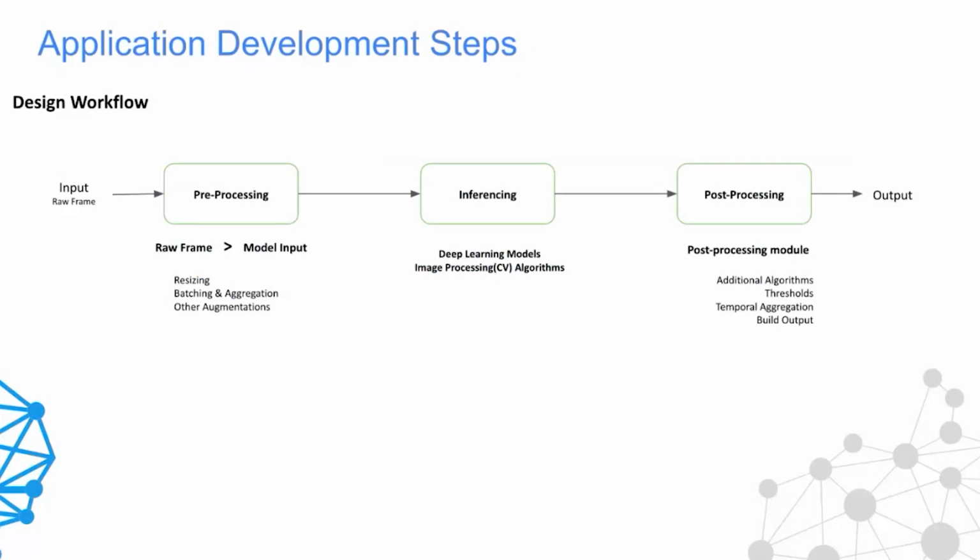So to build the application Cerebro, I have a simpler version of the application I'm going to go through. The first step as part of development of the application is to write down your workflow. To design your workflow, over here we have the input frame that is coming directly from the endoscope. Then we have the pre-processing layer. This is where dynamic crop or resizing, batching, aggregation, and any other augmentations can be performed. The inferencing layer is where we have our deep learning models and the computer vision algorithms. And the post-processing module is where we have the additional algorithms, the temporal feature aggregation module, and also the final overlay output that we are going to generate.